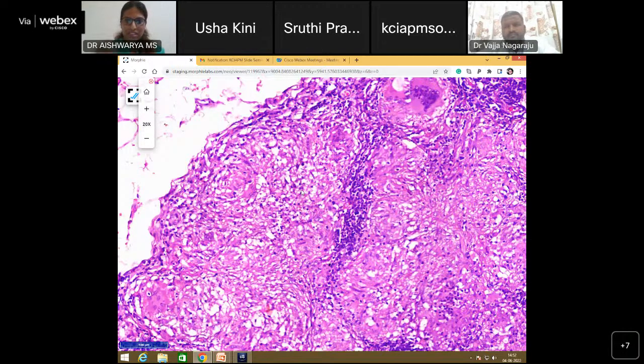Ma'am, if it is caseating, we would see amorphous homogeneous areas within these granulomas. And may see nuclear debris, right? Yes. So that is a combination of both liquefactive and coagulative, which we are not seeing. This is more likely to be liquefactive. So your use of the word non-caseating is acceptable in this situation.